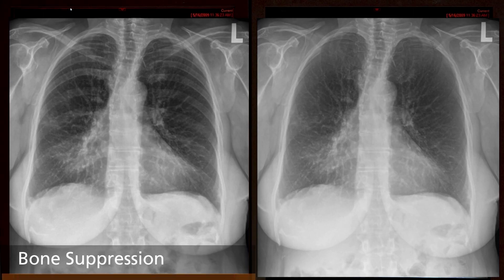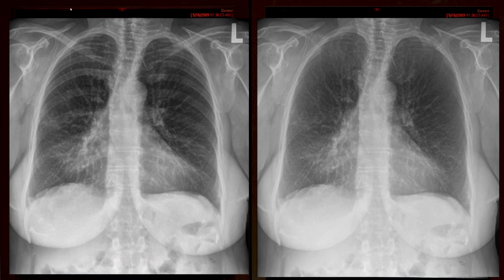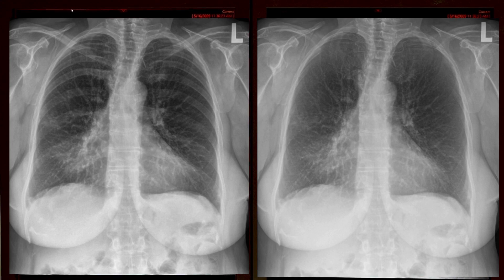Bone suppression utilizes AI to create a companion image, as shown on the right, that suppresses the appearance of bone and enhances the visualization of soft tissue. This requires no additional exposure to the patient and has the potential to increase the confidence of pathology assessment due to improved visibility.